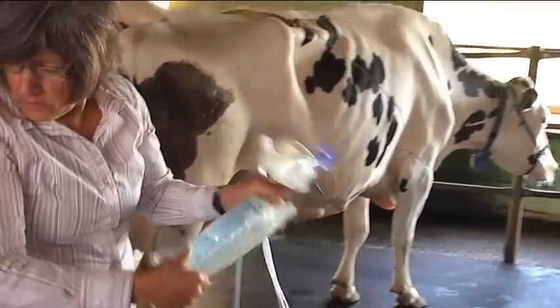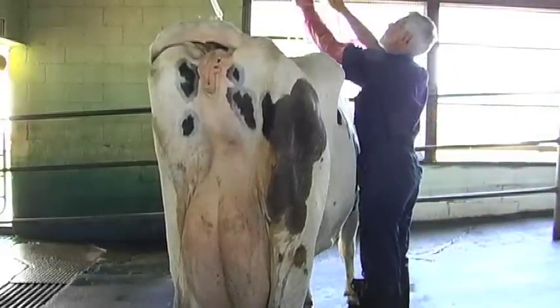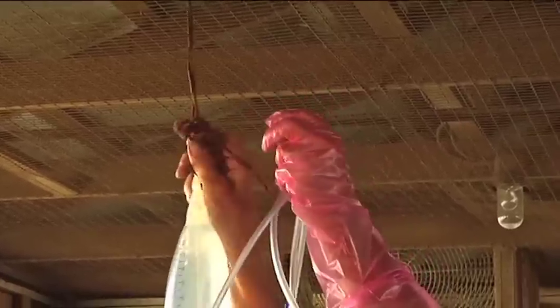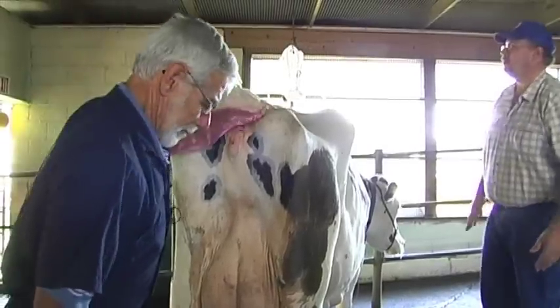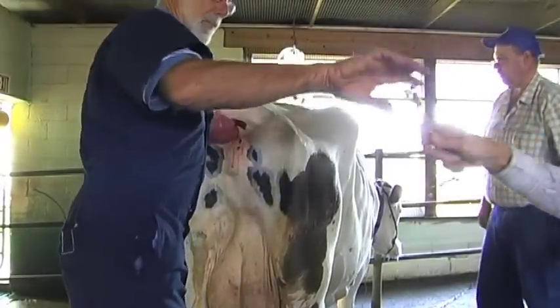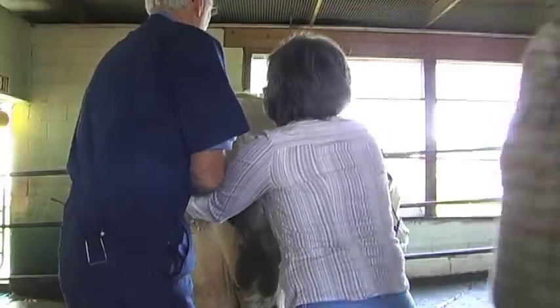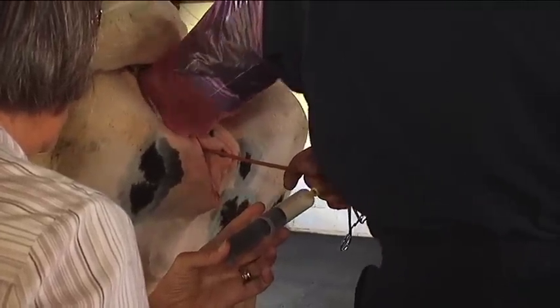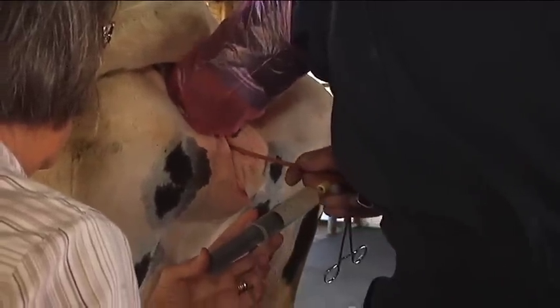The cow is now ready to be flushed. The flush solution medium travels through the catheter into the cow horn and helps facilitate the removal of embryos. The catheter is threaded through the cervix, directed into the left horn, and positioned a little past the bifurcation of the two horns. The cuff is then blown up to isolate the anterior portion of the left horn.